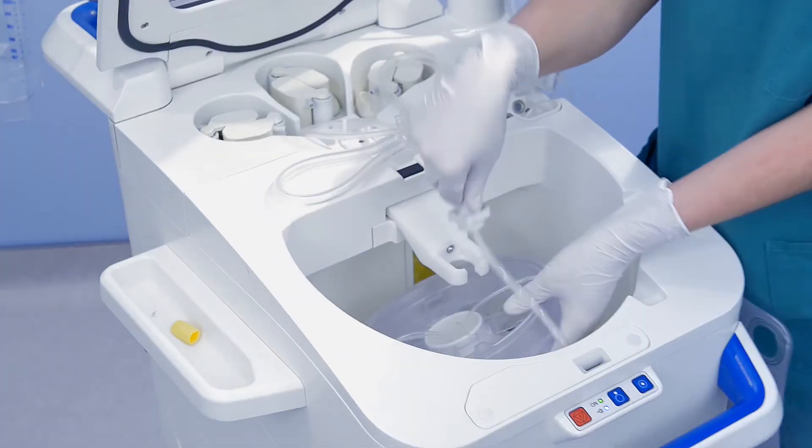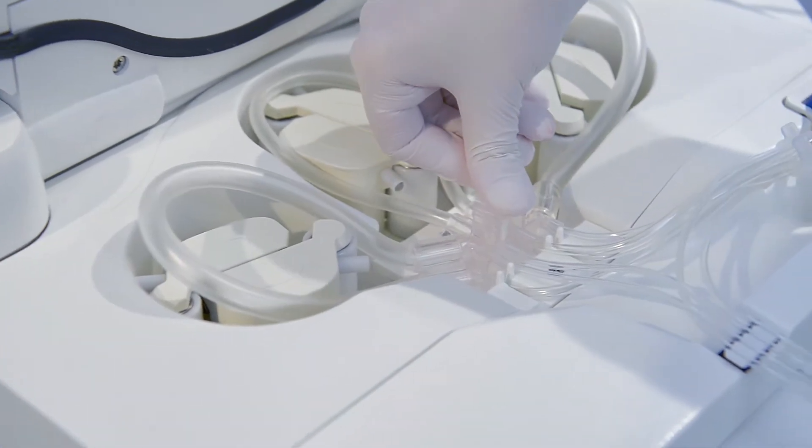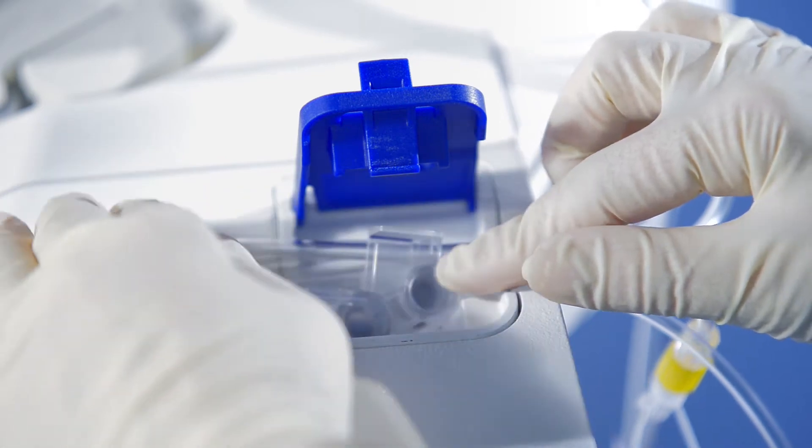Fit the centrifuge adapter until it clicks into place. Insert the pump adapter into the pump bed. Insert the hematocrit chamber in the chamber housing.